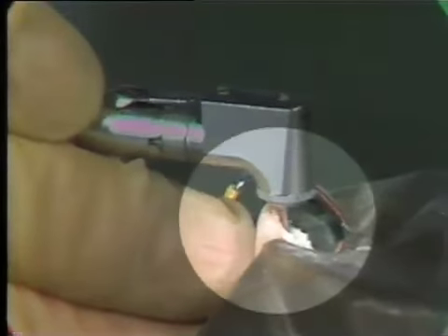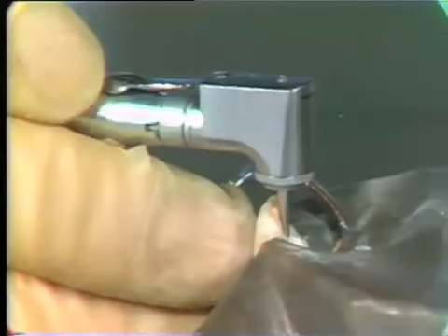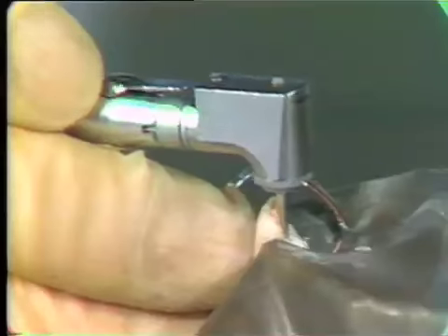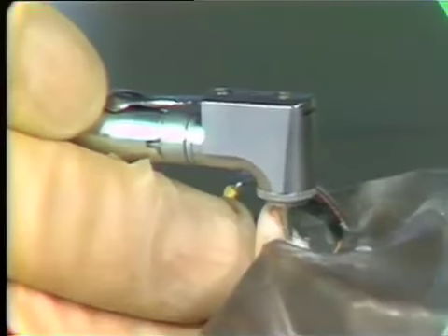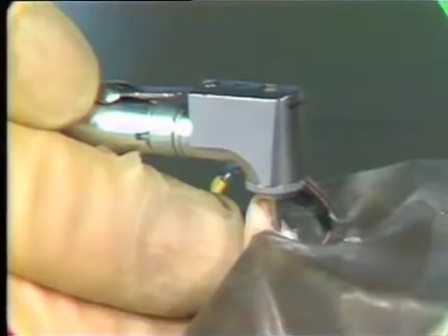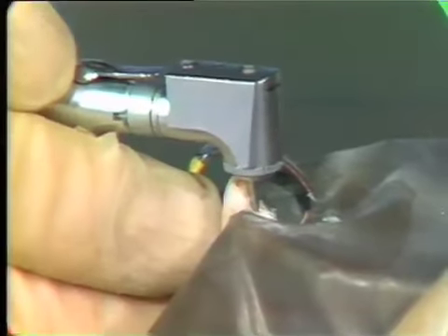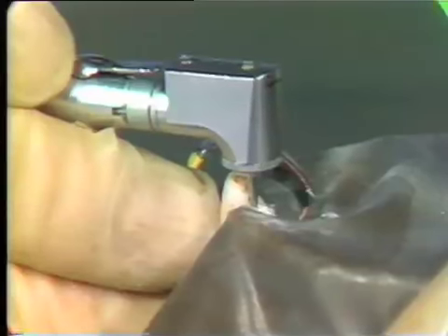I felt my burr fall into the pulp chamber. I knew I was there, so I stopped the handpiece. Now I feel where the roof is, where the walls are, so I know how to unroof the pulp chamber. I can feel the click, the bump of the roof. So I start my handpiece again and slowly unroof the pulp chamber.